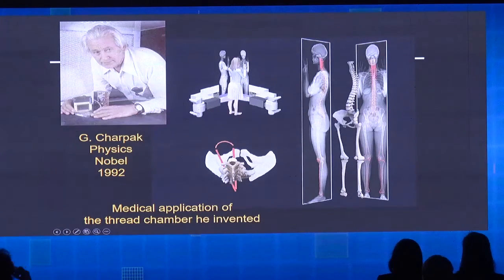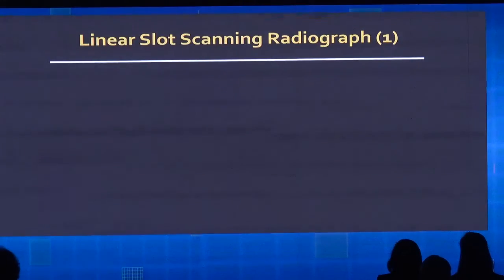So you have, in fact, two sources of X-ray, which are very, very thinly collimated, with, on the opposite side of the booth, a detector, and the two couples of tube and detector are moving simultaneously up, moving down, and are acquiring a AP and a lateral view of the spine at the same time, with a very minimal amount of irradiation. Nevertheless, it's very good, but it's not completely perfect.